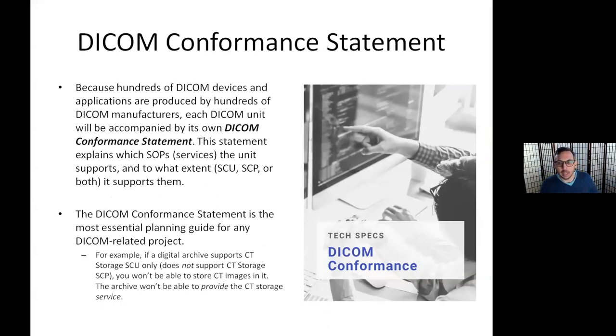And I mentioned before that the ultrasound is not going to interact with DICOM the same way that a CT scanner is, or the same way that a printer is, or a server is, or maybe a mobile app is. Each of these is going to have its own DICOM conformance statement. So they're each going to adhere to the DICOM standard in their own way. And sometimes this DICOM conformance statement is even more important than the manual. Because if you understand that DICOM language, then you're going to understand, oh, this is how it sends blocks of data. These are the attributes that it records. These are the IODs that it records.